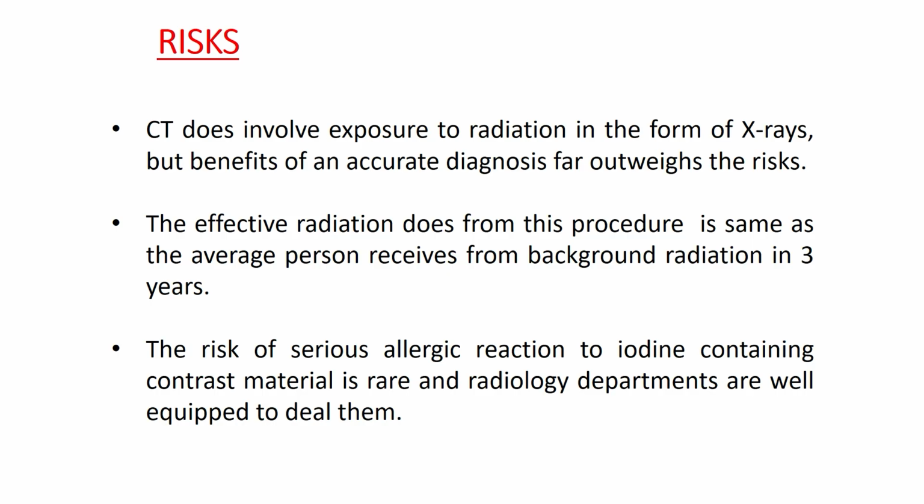Let us discuss the risk. The CT has only one major risk, the radiation hazard. The CT does involve exposure to radiation in the form of X-rays, but the benefit of accurate diagnosis outweighs the risk. The effective radiation dose of this procedure is the same as the average person receives from background radiation in 3 years.